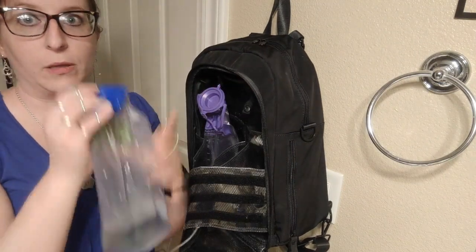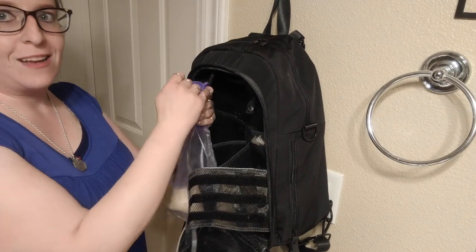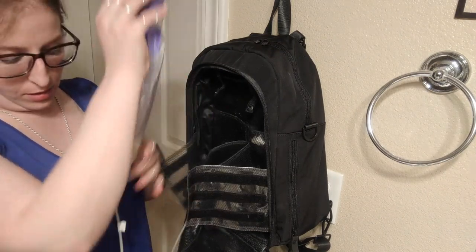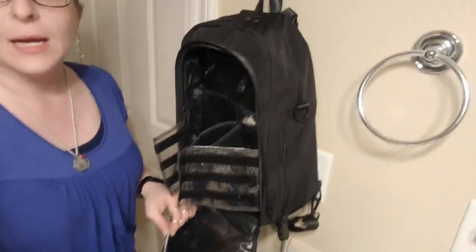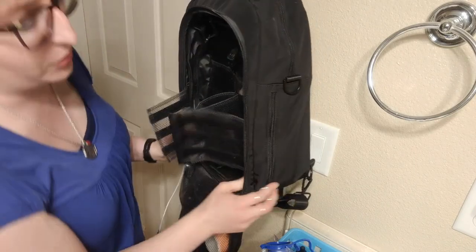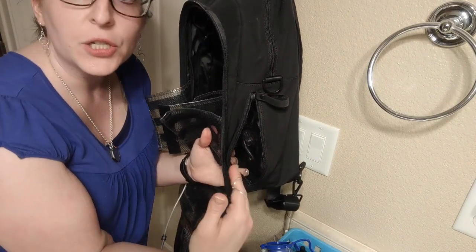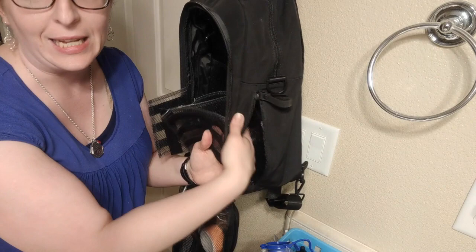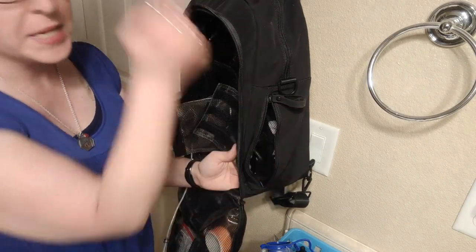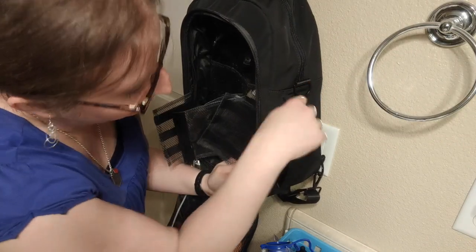Make sure you cap that so the residual flush does not leak everywhere. Put that to the side. Same thing with the feed. Cap that back. And then the line on each side here, I'll show it on this side. There is this zipper pocket. Now, if you have like the Infinity pump, you can actually operate the pump just by sliding it in and out of here. Or some of the IV pumps will also fit there. But on this side, because of the way the Joey is designed, my line has to come out of this other side. So, set that back up.